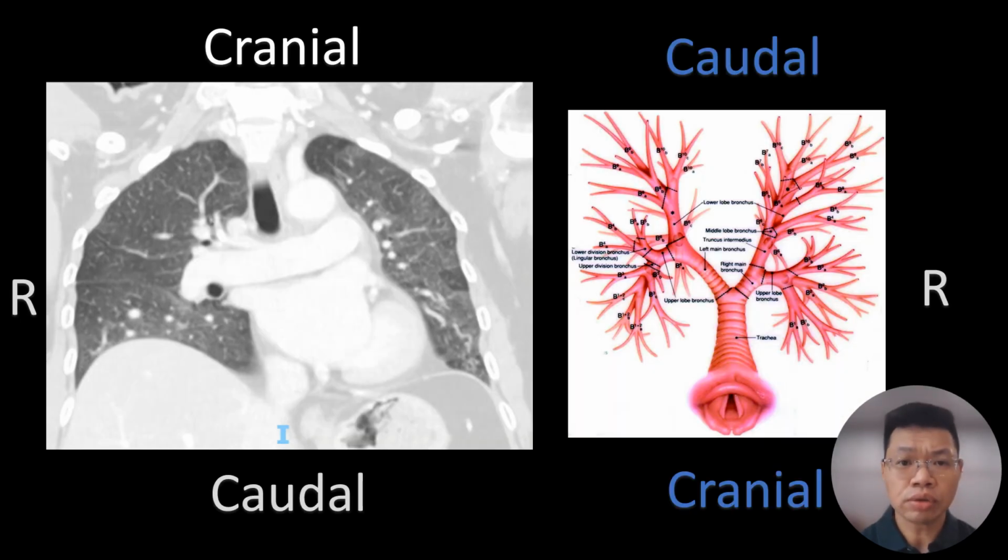It is crucial to understand the movements made by the bronchoscope, as these are the same movements which we will need to make to orientate the CT scan. During bronchoscopy into the middle lobe, we are moving in a cranial to caudal direction, where we take a right turn at the carina before moving in a posterior to anterior direction within the middle lobe. Pay attention now to the 3D image which demonstrates the movement of the posterior to anterior direction.